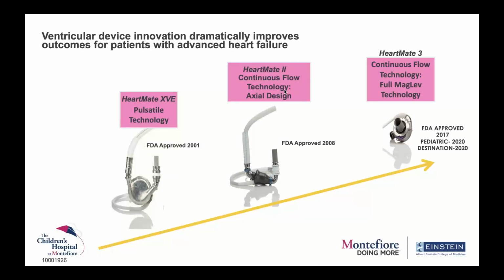So ventricular device innovation has dramatically improved outcomes for patients with advanced heart failure, both in adults and in pediatrics. We started with the HeartMate XVE back in 2001 that the FDA approved, and this was a pulsatile VAD. What that means is that, like how we feel our pulse, the heart is pulsatile, so with every beat you feel a pulse. That is what the HeartMate XVE was.